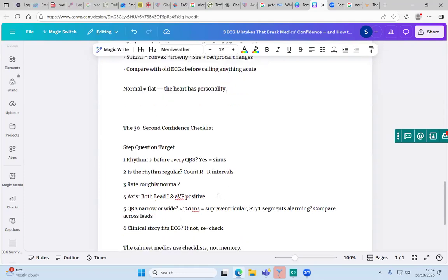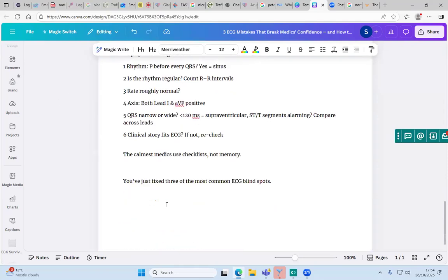Just know in your mind that you should not panic. Take things sequentially, scan your ECG, right? And compare with previous ECGs. You can investigate, you can do serial ECGs if you're not sure, but with time, your confidence builds and you know how to draw the fine line between complacency and being too panicky.